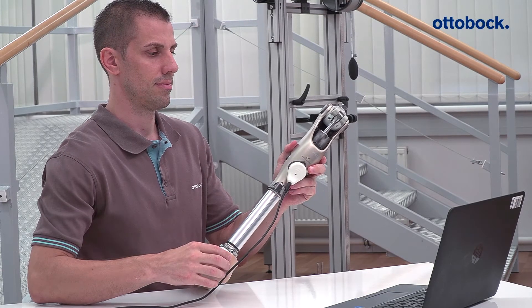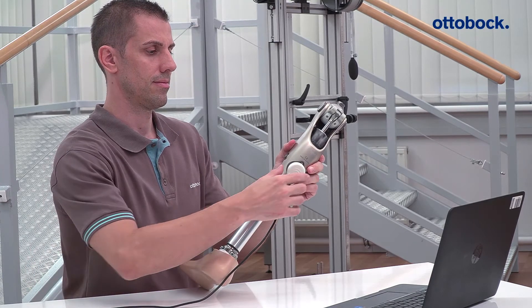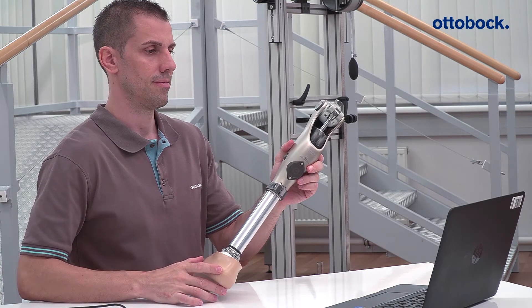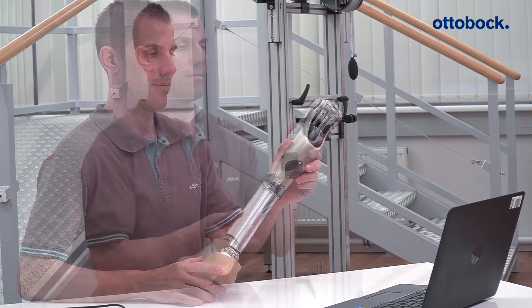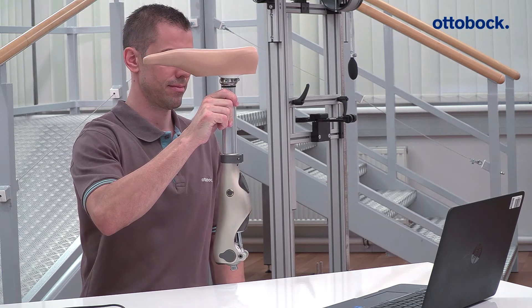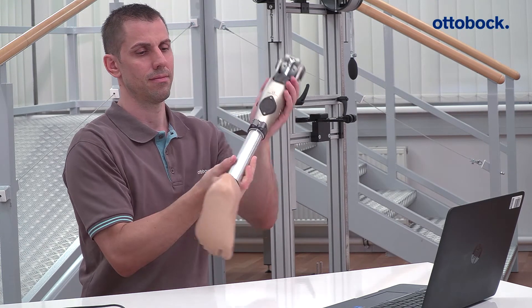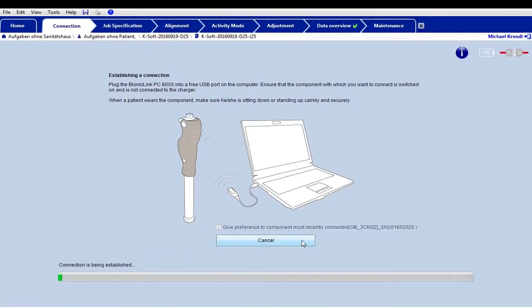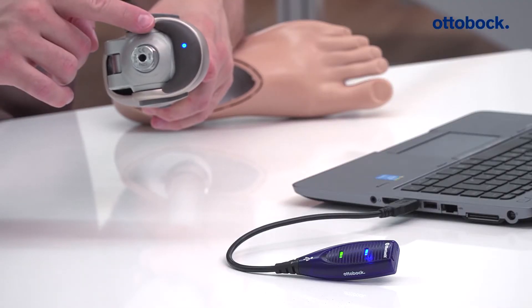Switch on the knee joint for the bench alignment of the prosthesis and activate Bluetooth through it for two minutes. Bluetooth can be activated for a further two minutes by rotating the joint 180 degrees. Then connect the Kinevo with Ksoft. As soon as the connection has been established, the control LED on the knee joint and on the Bluetooth dongle will light up blue.